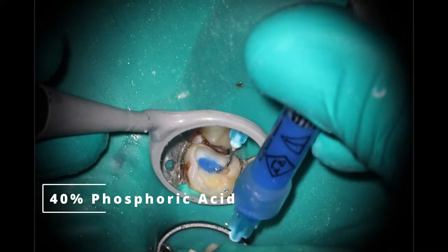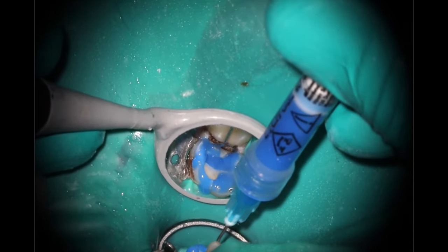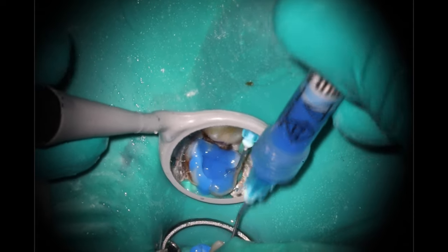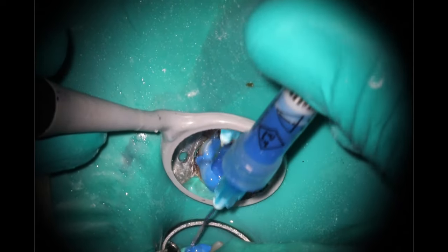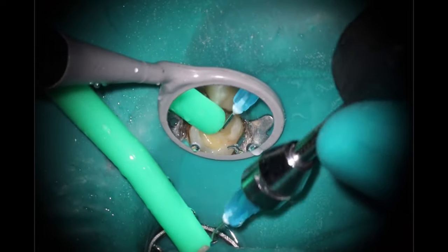I can see the bleeding's looking well controlled, so we're going to go on to the etch process. Is this the time when you start mixing the prime and bond? Correct — at the etch, I then mix the prime and bond because we're going to use that next. This is kind of a built-in — we know it takes about 15 seconds for the etch to work. During this time I've handed it back to her; I'm getting ready with my water to rinse it out. She's already mixed everything at this point.